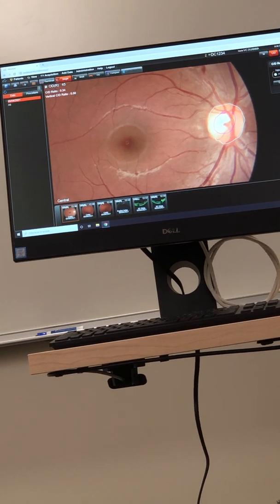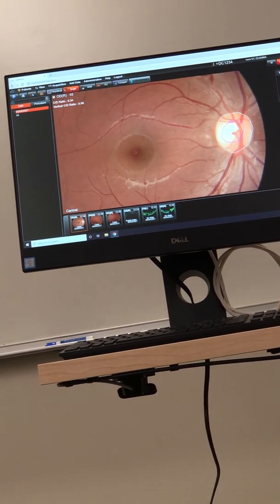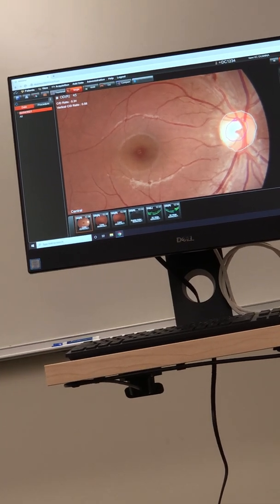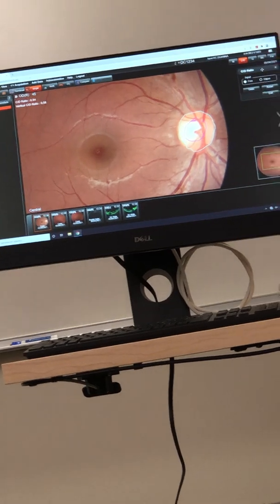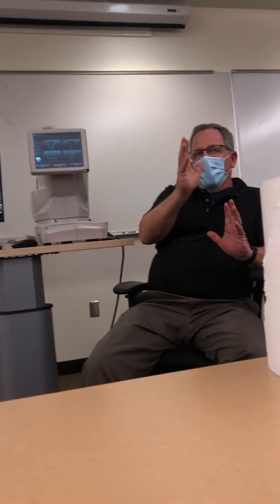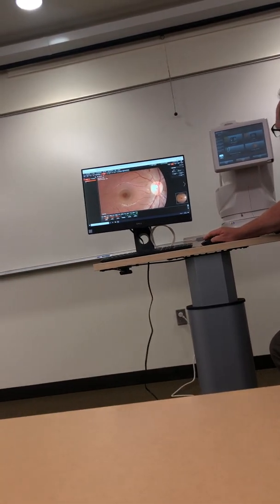How would you know it's exact if you're free drawing? Well, it's not rocket science. You could be off, and you would have to be off a very high amount to get the ratio to vary. I don't know if I can really explain it. Here, we can do it again, so let's delete.